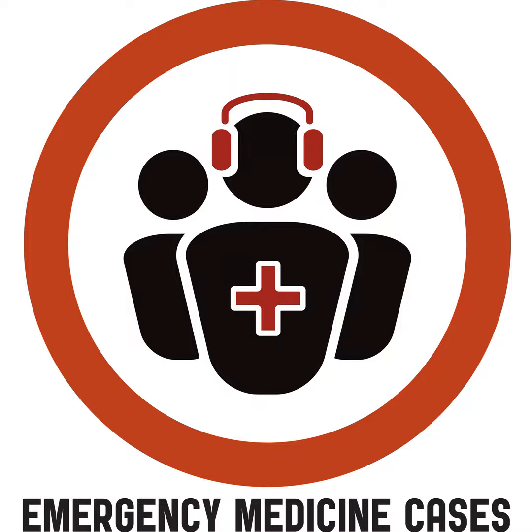A foot rule, just be careful. The Ottawa foot rules are not for anybody with a foot injury and who needs an x-ray. They're for somebody who injures their ankle, has pain in their foot, and needs a foot x-ray on top of their ankle x-ray. By example, I had a patient I saw with a resident, and this patient had a 45-pound plate working out in a gym. It fell on their third and fourth metatarsal necks. They were not sore over the navicular. They were not sore over the base of the fifth metatarsal. They could take 4 steps on their heel, no problem. By the Ottawa ankle rules, they don't need a foot x-ray, but that's not what the rules are about.